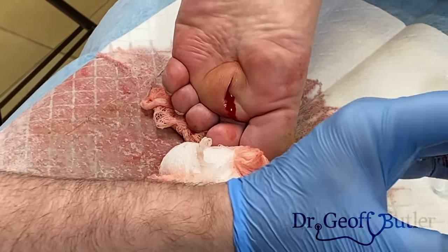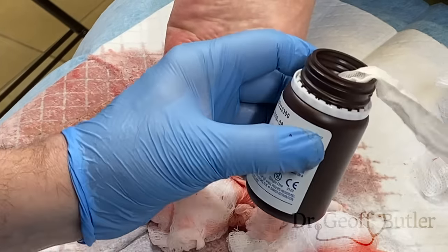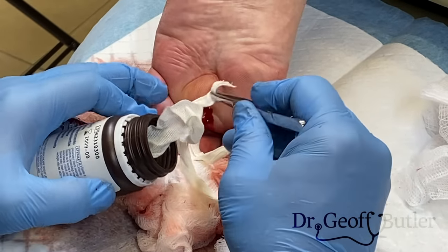Maybe this one is a little bit bigger but can fit. Good, but not ideal. Let me check — I just want to see how we tolerate it, because that's the problem when we're shoving it in.